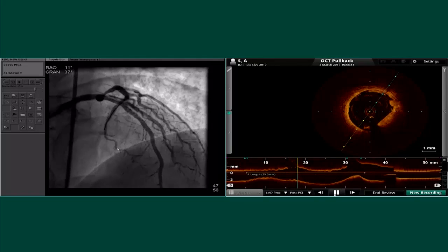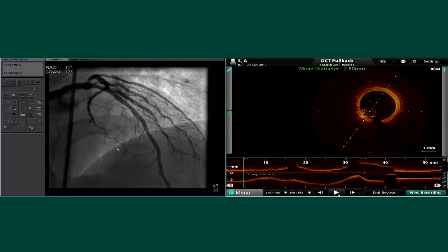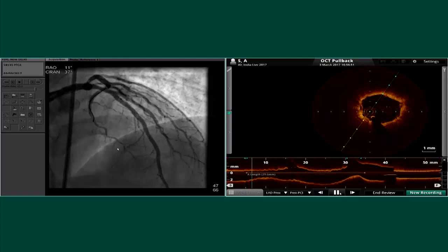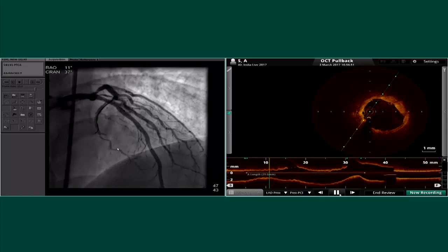Go to the OCT. Okay, so this is the OCT now. You can see distally coming back. And I think I'm going to do a higher pressure dilatation at this point.